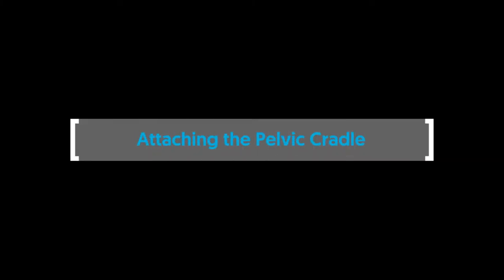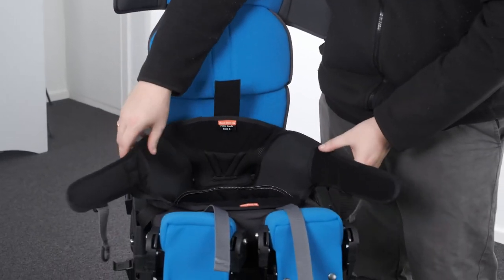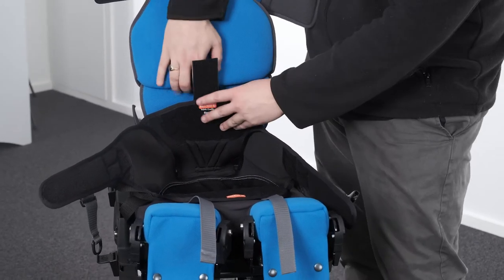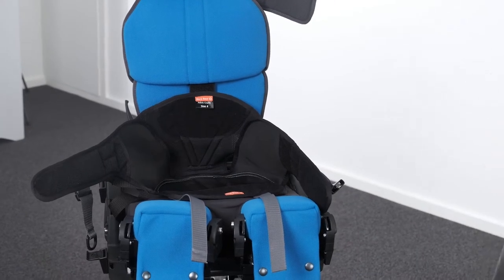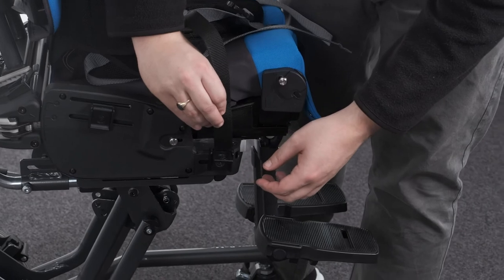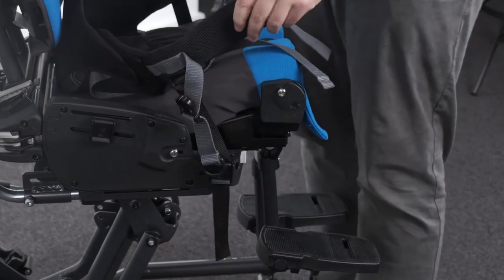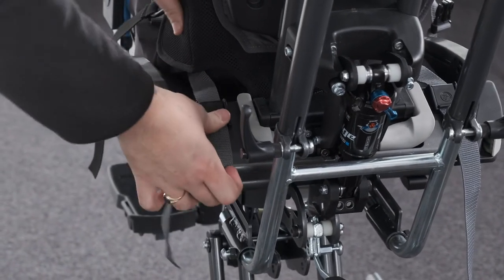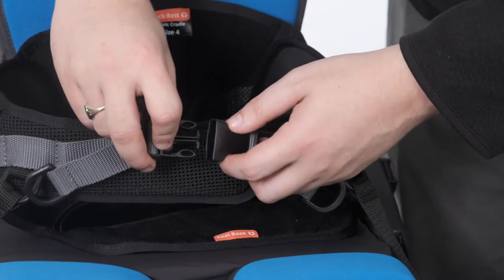Attaching the pelvic cradle. Place the cradle on the seat base cushion — the pelvic cradle is labelled to indicate the correct orientation. Attach the rear velcro strap up into the cavity within the thoracic backrest cushion. Pass the black webbing through the cam buckles at either side of the front of the seat and secure the cam buckles. Pass the grey webbing through the cam buckles at either side of the back of the seat and secure the cam buckles. Attach the buckle at the front to secure the user.